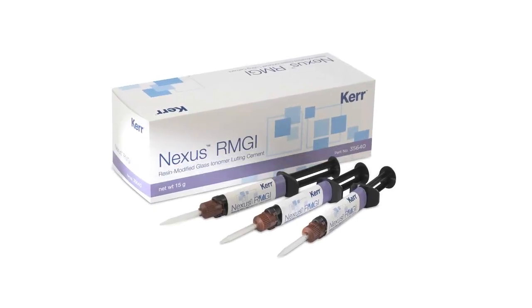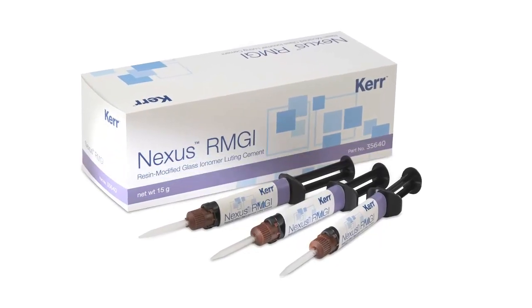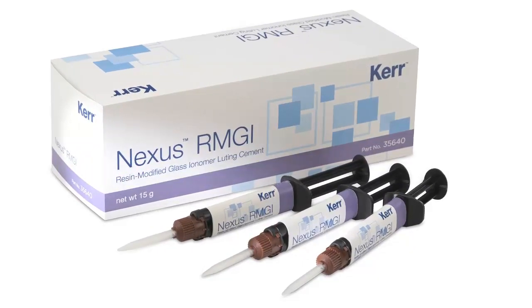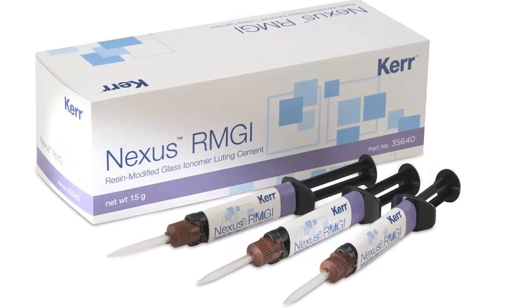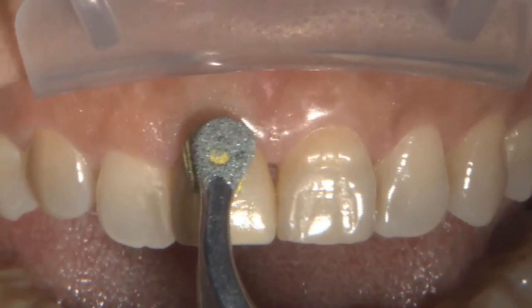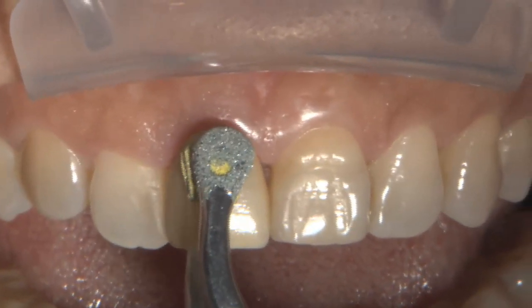I'm Dr. Michael Dottola, and I wanted to share with you a new cement from Kerr that I've had the pleasure to use. This is Nexus RMGI, a resin-modified glass ionomer luting cement that's based on the Nexus adhesive technology, which many dentists have come to know and trust over the years. I wanted to take you through a clinical case here.